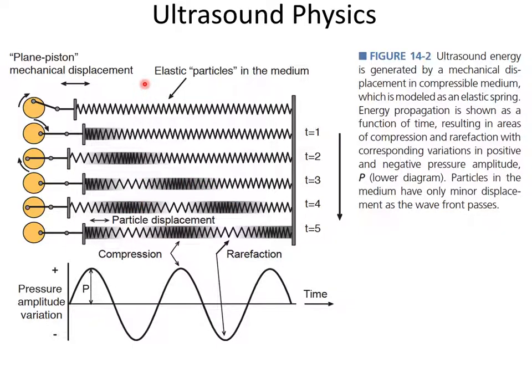The shape of that wave as it's moving through the material depends a lot on the compressibility of the material, or the sonic impedance of the material. Something that's highly compressible, like air, it turns out the sound moves more slowly through the medium, versus water, in which the sound travels faster.